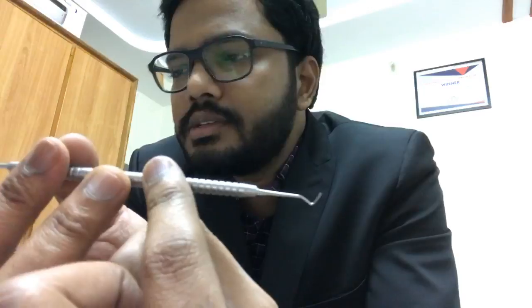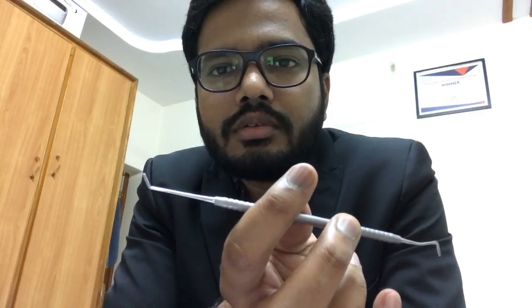I was under the impression that I could accurately focus these instruments, but no. Yeah, enamel hatchet, right? So enamel hatchet, it's mainly used for removing unsupported enamels and to plane the surfaces of cavity. Yeah, to remove unsupported enamel, lip of enamel, all that, right?